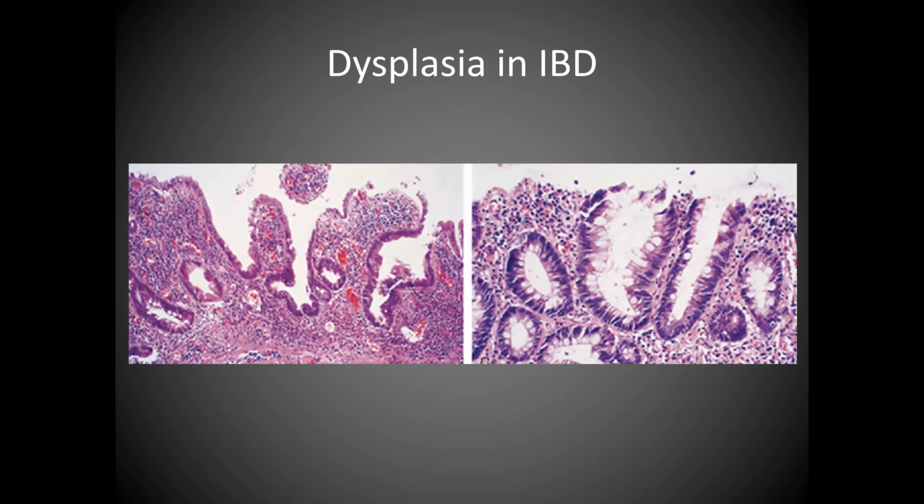So here's an example. Which of these is dysplasia? Well, here we see a lot of blue material, but we don't have surface. One of the things we'd like to see is what's going on the surface. And so we don't usually grade dysplasia just based on what's in the crypt. Likewise, here's some abnormal architecture, but as we look at the surface, it looks relatively bland. And there may be that there's active inflammation here. We don't like to grade dysplasia when there's active inflammation.